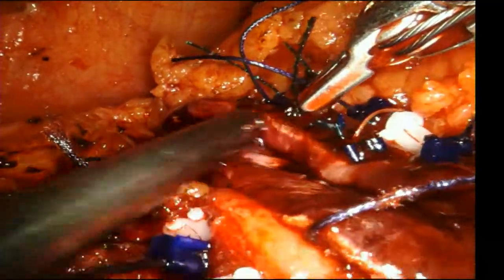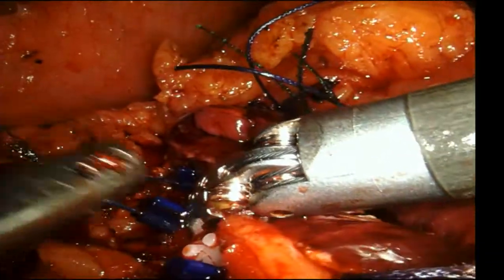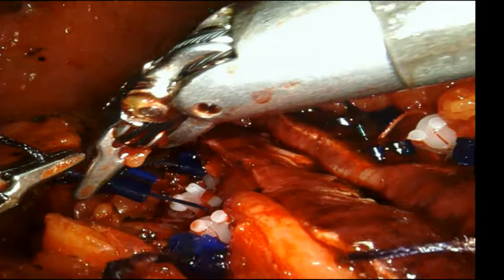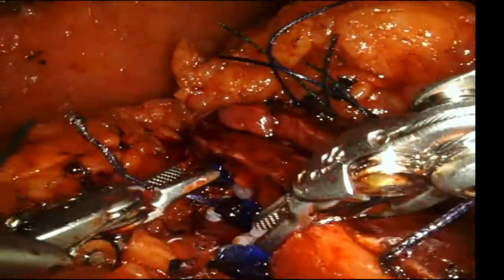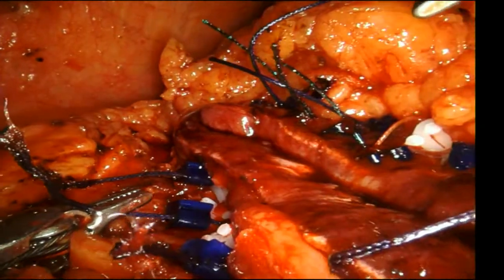He's a little concerned about the depth, as we talked about. Yeah, that's what I was saying. You've got to go after the same depth as that initial layer. You don't want to go too deep. You have to try to get into that same layer as the initial deep layer, because that's already in the ischemic zone. Oh, this is sliding. Can we get another?